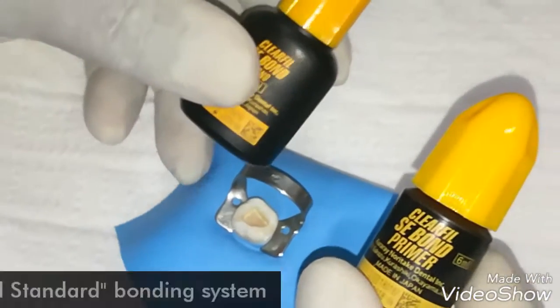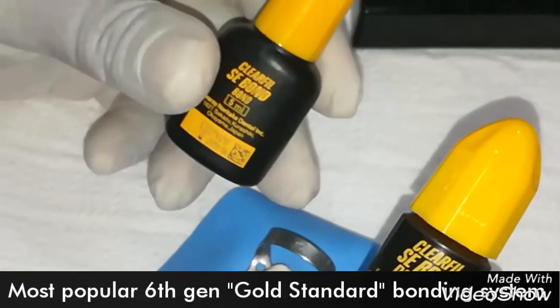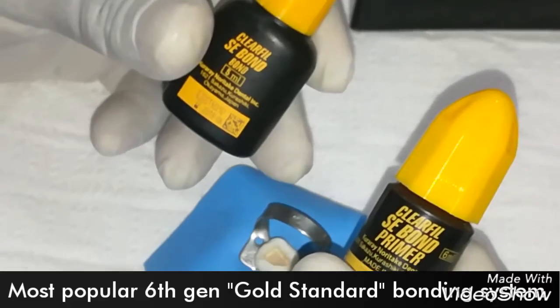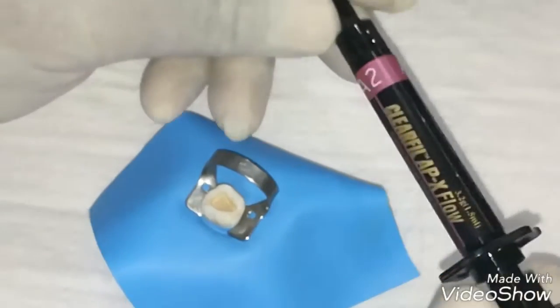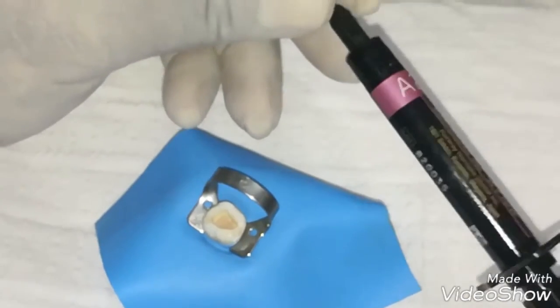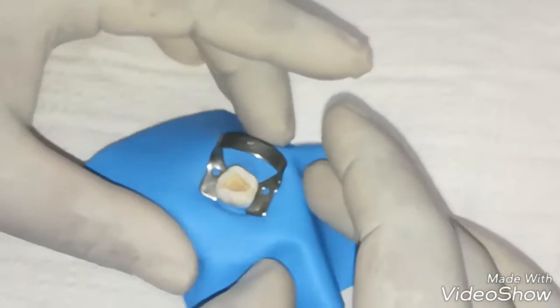First I choose the 6th generation bonding system from Kuraray, that is called the Clearfil SE Bond, which has a self-etching primer and bonding system. I also have Clearfil APX high filler content flowable and also Clearfil APX packable composite.